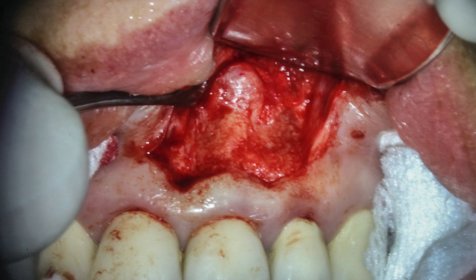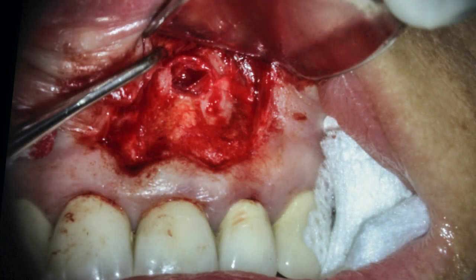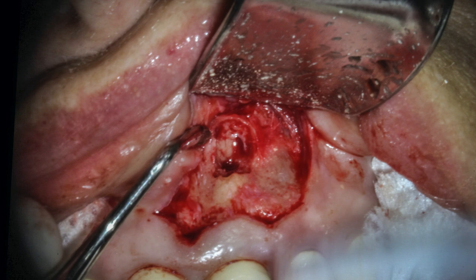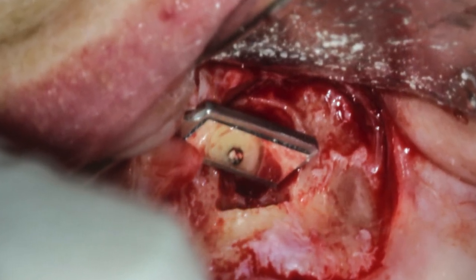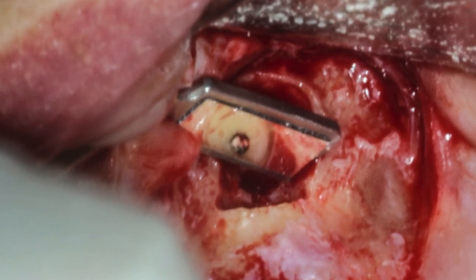The flap is then reflected to expose the surgical field and the area around the apex of tooth number nine. We can see that mild swelling occurring. An initial osteotomy is placed through that thin bone, and a portion of the tissue is removed and sent for biopsy. I generally send all tissue samples for histological biopsy just to confirm it is what I think it is. Following removal of the initial tissue and exposure of the root, I then section off three millimeters of that apical segment. Looking at the remaining root structure, we can see that the obturation material in that root canal system is really contaminated. This is a concern because we're not re-treating the internal root canal system even though that's where the etiological factor is coming from. Taking this approach has risks — leakage can still occur despite our best efforts. But I still think it's the best choice in this scenario given the risks of disassembly and post removal.